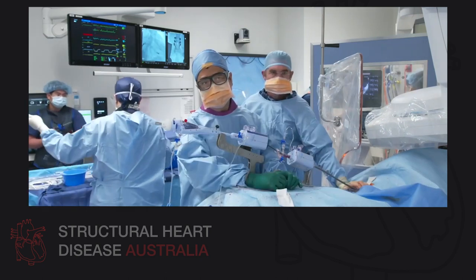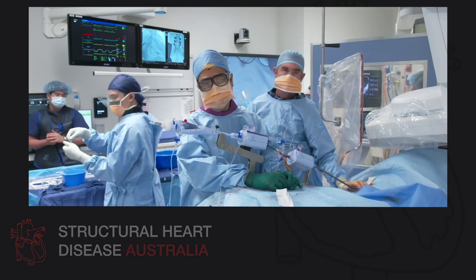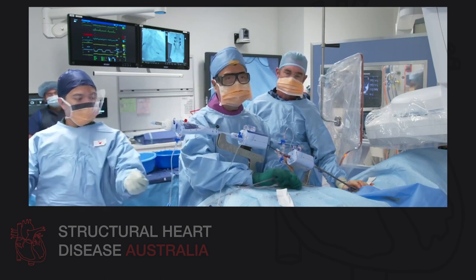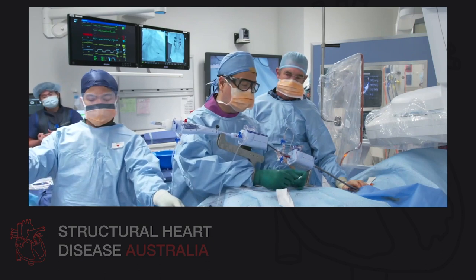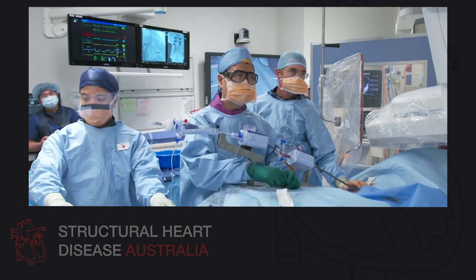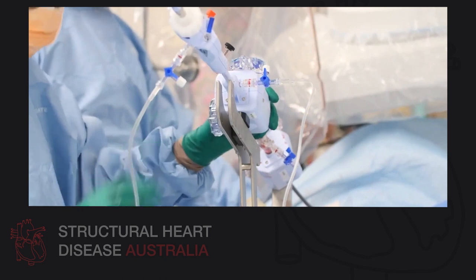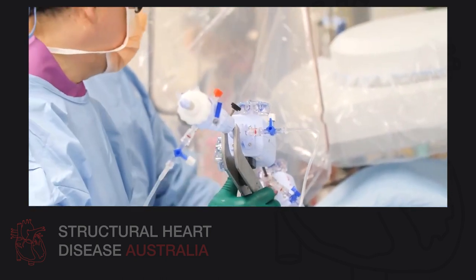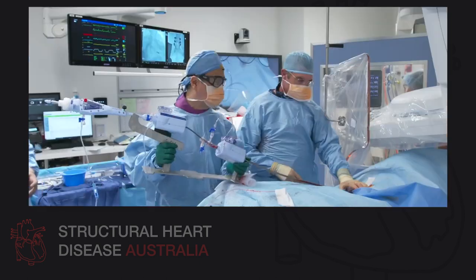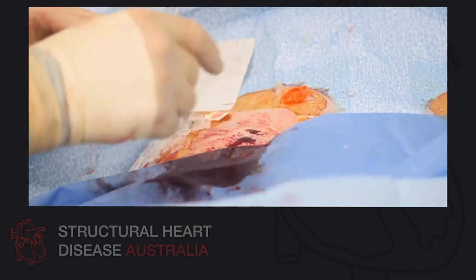So we've deployed a single mitral clip XTR prosthesis between the A2 and the P2 scallops of the mitral valve, slightly medial to the center line, but at the side of maximum anterior leaflet prolapse. In this patient that has a mixed anatomy of atrial functional mitral regurgitation and anterior leaflet prolapse. We're going to pull the mitral clip catheter system, entire system out now, and Dr. Wilson's going to close the groin for me. We have a single pre-closed ProGlide at the groin pre-deployed for pre-closure. Thank you. So we're all done.